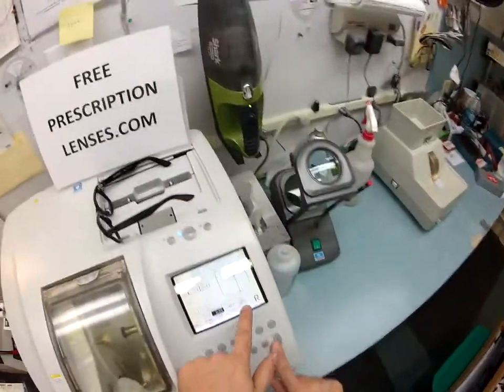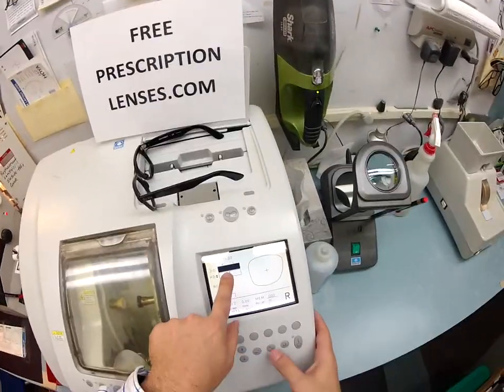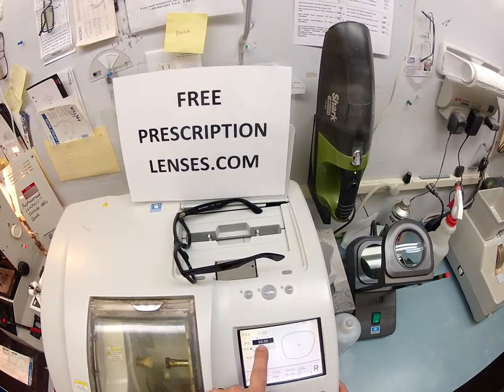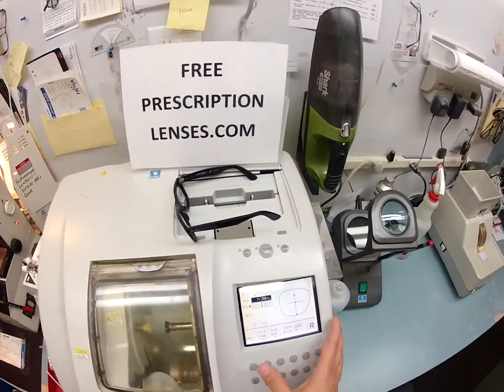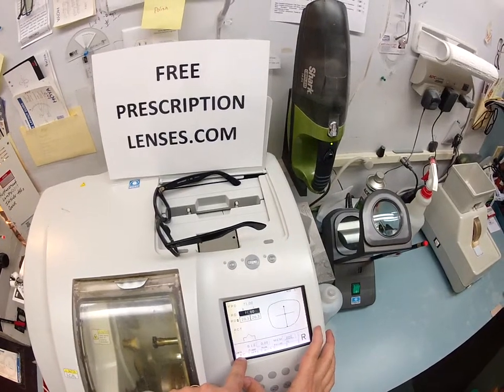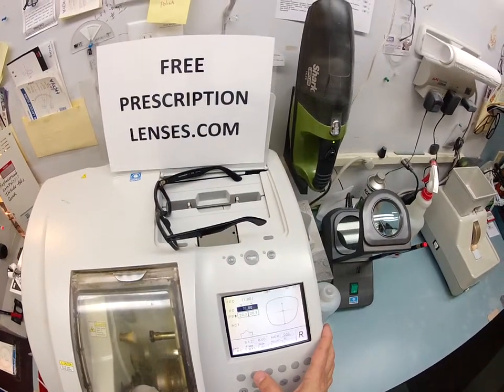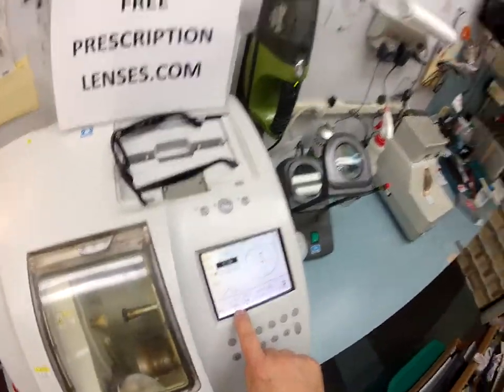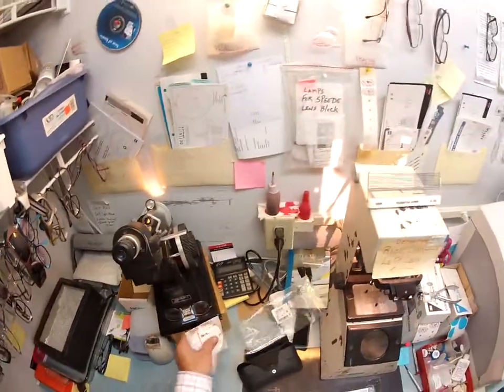I'm going to put your frame into my Italian Santinelli LE 1000 edger. It is going to trace the shape of your right and left lenses. I'm going to pull the shape up on my computer. This is a polycarbonate lens cut on the soft cycle because of the anti-glare, which I'll explain in a moment. And it's being cut for a zyle frame, which is the old school name for plastic.